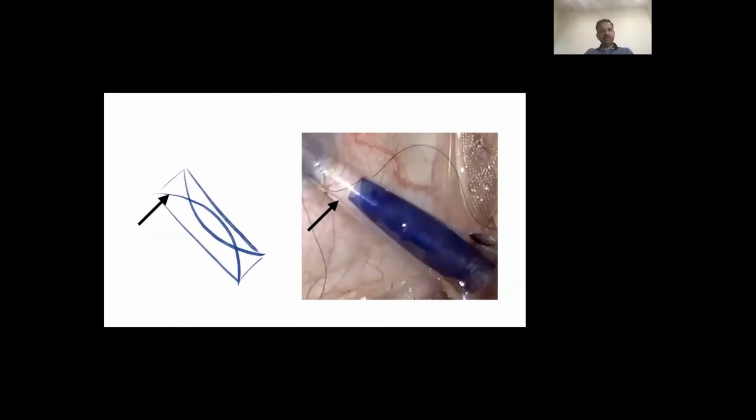You can load the donor tissue either from the tip. Make sure your nurse keeps replenishing the fluid in that corneoscleral rim, because sometimes you run out of fluid and your donor tissue has not yet come into the tip of your cartridge. Or you can take the tissue into a glass Petri dish and you can load it from the broader end of your injector, as what we do with a glass injector from Geuder. So this is what I was talking about, the open end of the scroll. You can see this V pattern that you see at the tip.